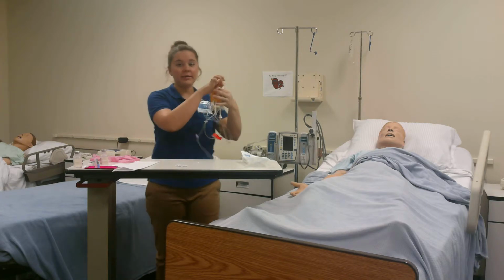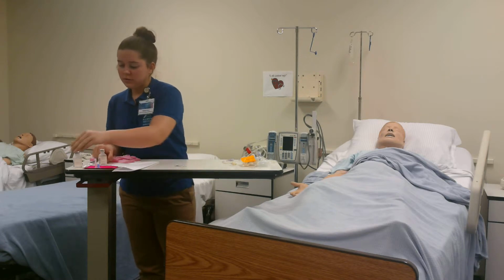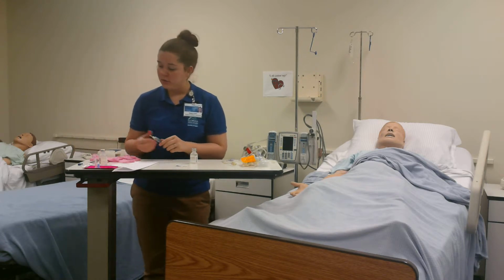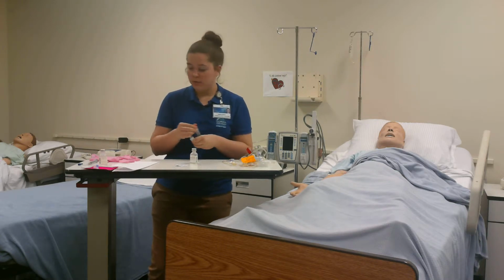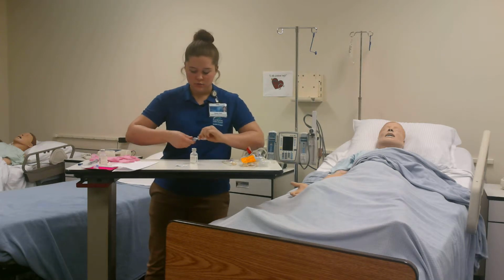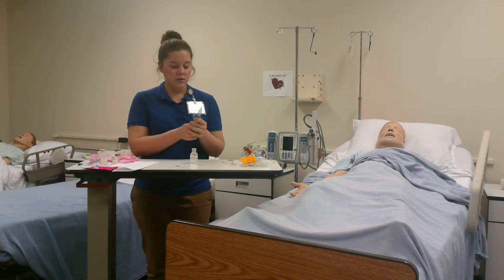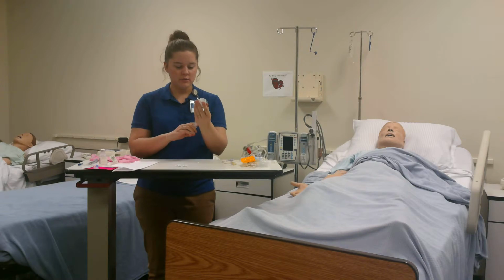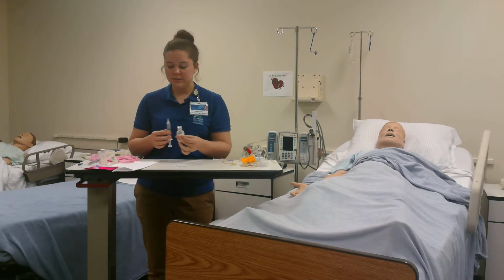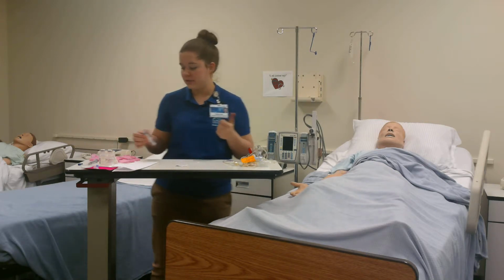Okay, and now I'm going to get my saline ready. Saline, needle, and a sterile plastic cannula. Okay, and we're going to draw 6 milliliters of saline in a 10 milliliter syringe. We're going to put our air in there, and we're going to draw back 6 milliliters. Okay, and now we're going to go into our patient's room and explain the procedure to him.